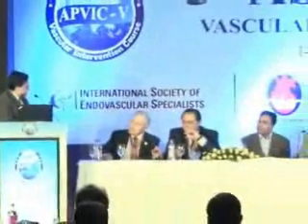Thank you. That was a very fine case presentation. There's a fellow by the name of Craig Walker, who's from Houma, Louisiana, who has done many of these, and he's a big proponent of the pedal access. He makes some good points, which you pointed out, and that is to put the balloon in bareback without using a sheath in many instances, keep the puncture site small. His data looks very good from that. I think it's probably a much better way than trying to come from above and get through vessels that are very difficult to get through.